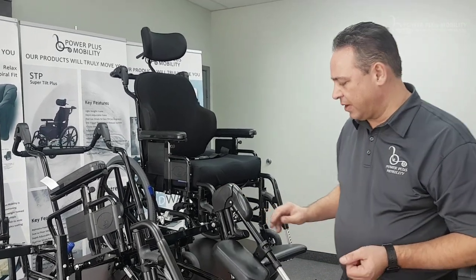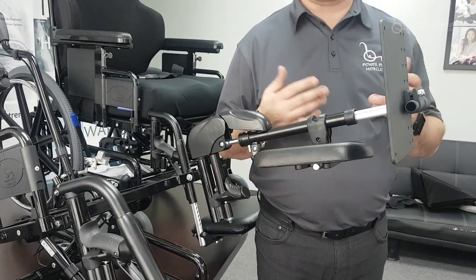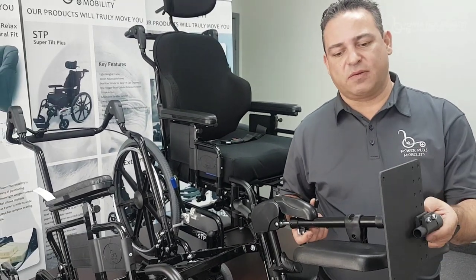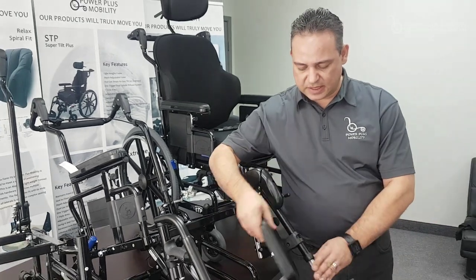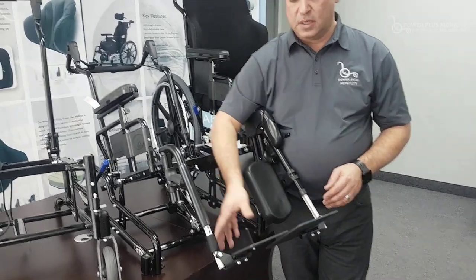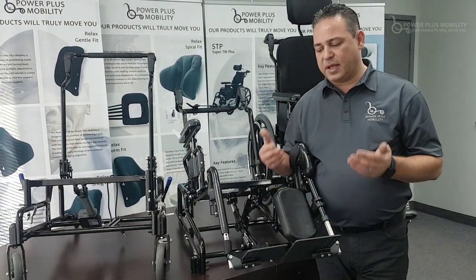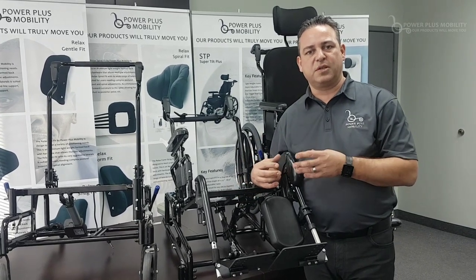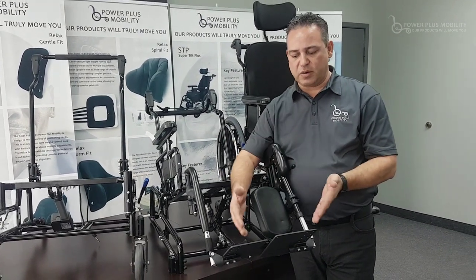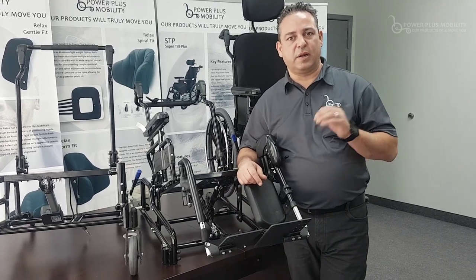We also have a type of front rigging that elevates. For somebody who perhaps has a broken leg and is in a cast for six weeks and renting a chair temporarily, we'd like to have elevating leg rests. These are elevating leg rests with a standard calf pad along with different sizes of angle-adjustable foot plates. These foot plates also angle and come in different sizes. Power Plus is well known for ensuring that when a chair comes into our system, our dealer network doesn't have to specify small or large foot plates — we always put foot plates with the least amount of gap, as a standard production quality assurance when it leaves our building.